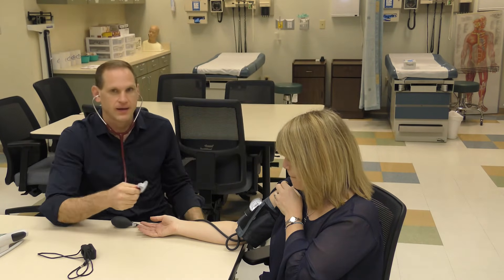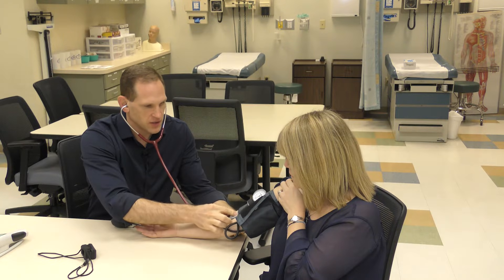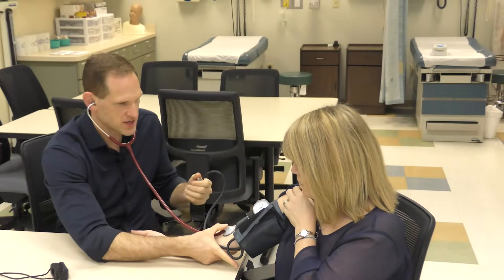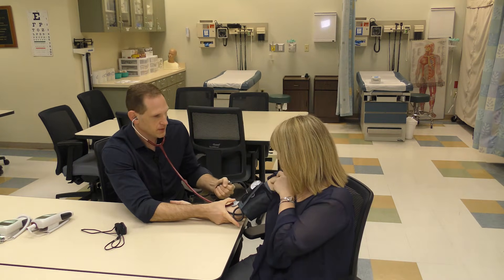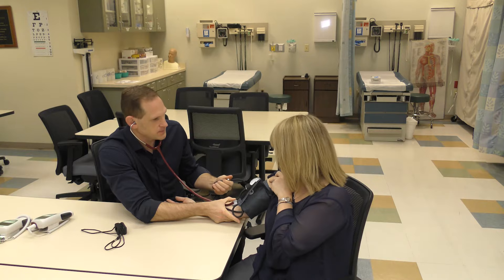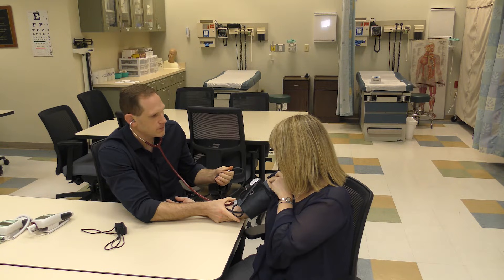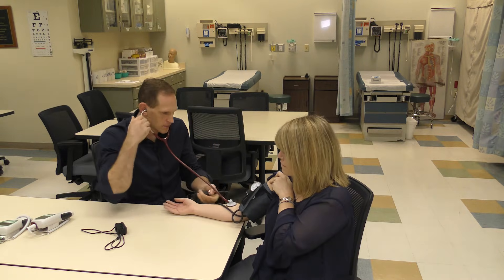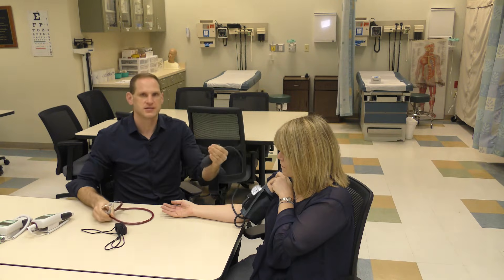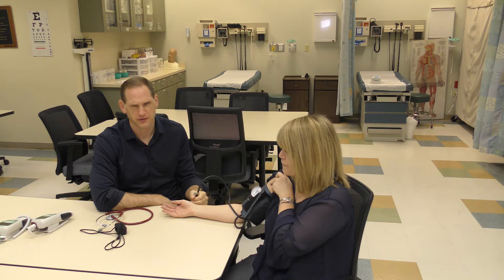Put your stethoscope in — you can use either the diaphragm or the bell if your stethoscope has one. Make sure you get a good seal on the patient's arm; a lot of times the edge is lifted up and you can't hear anything. Make sure there's a really good seal, you can see the dial well, and pump it up 30 millimeters higher than you just palpated — in this case that will be 140. Let it out at about two millimeters per second, listening for the very first sound, which will sound like a pulse: bump bump bump. The first bump is the systolic pressure, and when the sound goes away the last sound you hear is the diastolic pressure. These are called Korotkoff sounds, named after Dr. Korotkoff who discovered them.